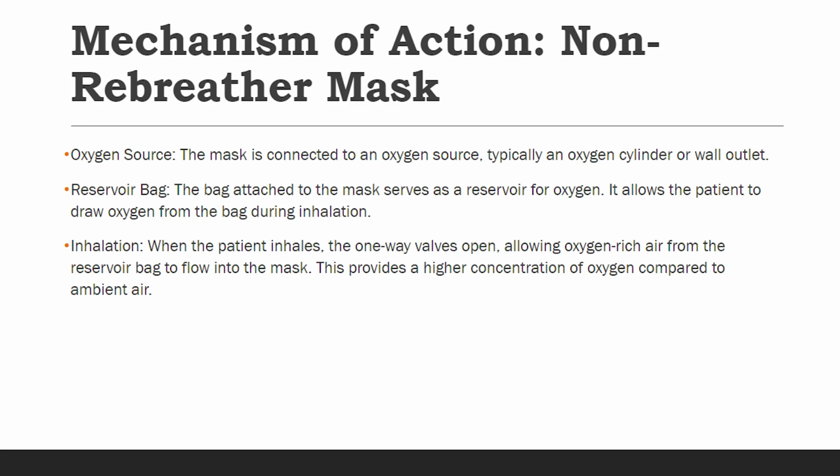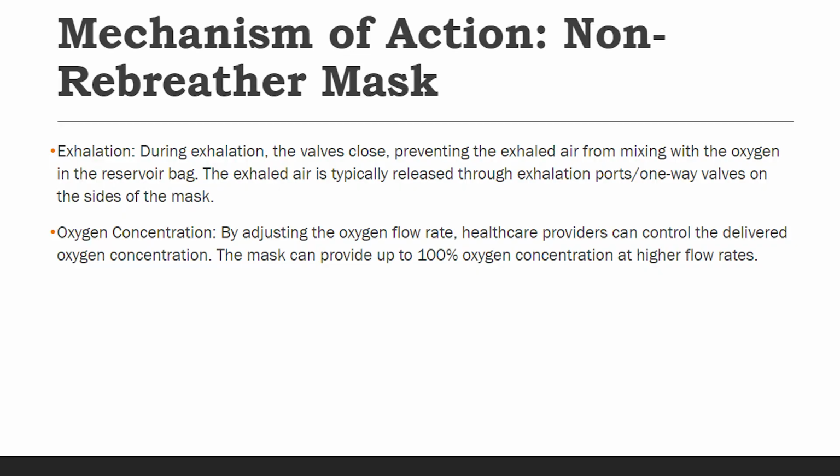During inspiration, slight negative pressure closes the expiratory valves, preventing air dilution. Simultaneously, the inspiratory valve on the top of the bag opens, providing oxygen to the patient. During exhalation, valve action reverses the flow. Slight positive pressure closes the inspiratory valve, preventing exhaled gas from entering the bag. Meanwhile, the one-way expiratory valves open, directing the exhaled gas out into the atmosphere.